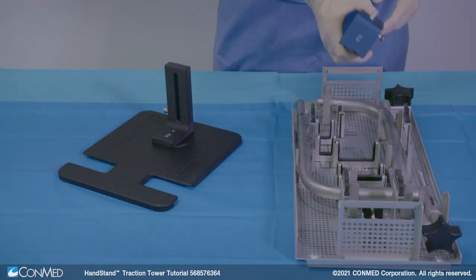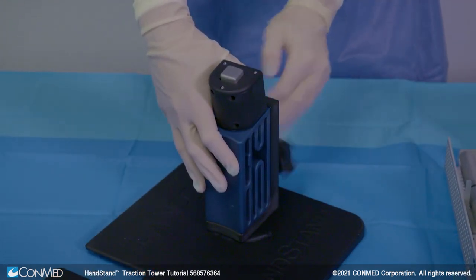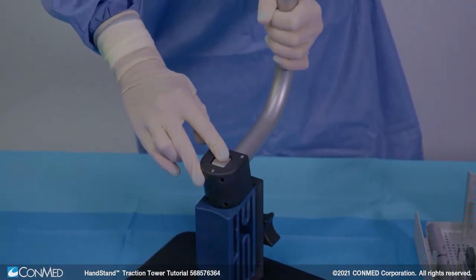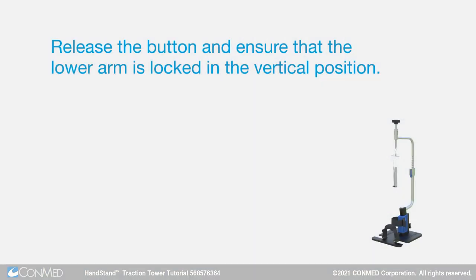Next, connect the upper tower and rotation joint into the lower tower with the tower locking knob. Depress the silver button on the top of the upper tower and rotation joint and insert the lower arm into the rotation joint opening. Release the button and ensure that the lower arm is locked in the vertical position.